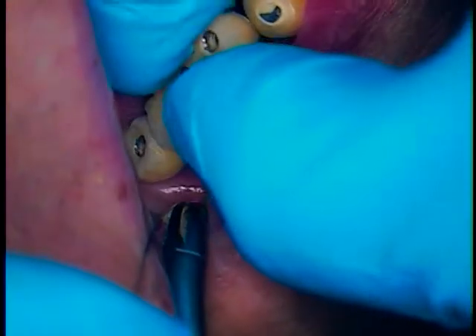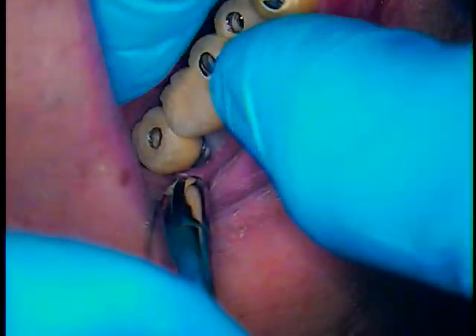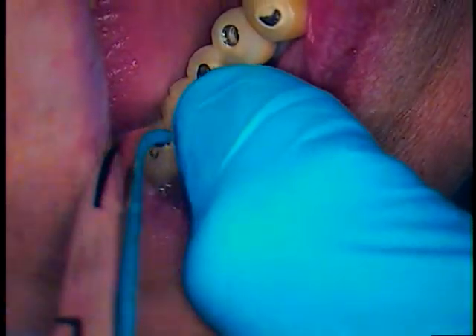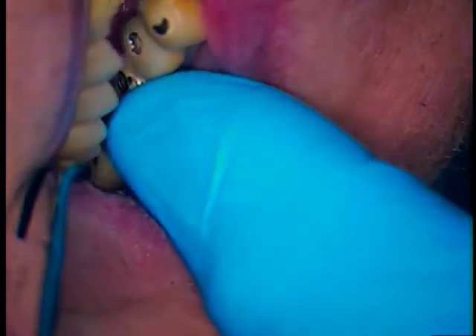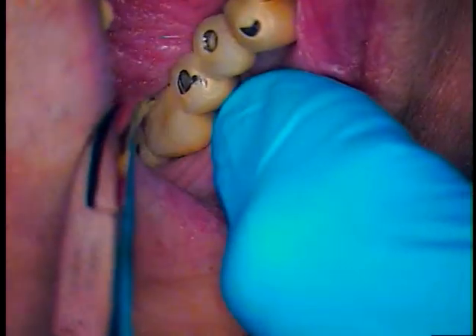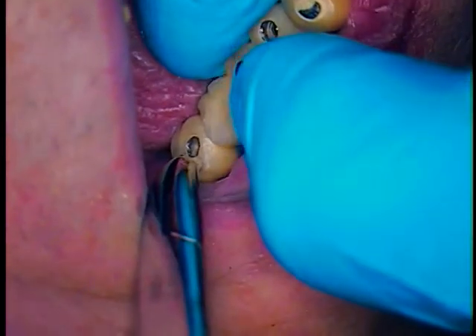Let's try our bridge in again. That bridge seats nicely. I want you to close down for me all the way. Tap a little bit — pretty close, right? Open. All right, great.